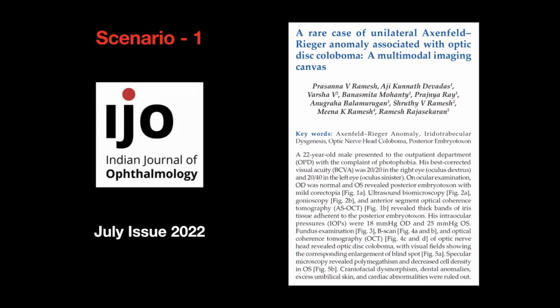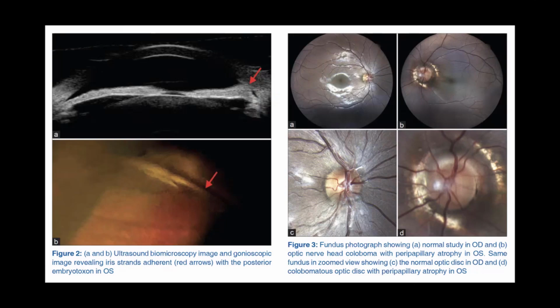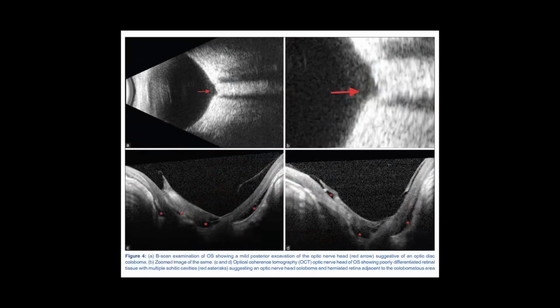And these are some of my PubMed indexed publications. Each image that I'm pitching, see how I am pitching it. See the corectopia, how you are pitching it. You have to give a prompt in such a way that the pupil should be seen being pulled towards the extreme, the nasal side. So when you're pitching it, see this, you're cutting it, the pupil has already gone to the other side, and you're showing the same syndrome matched with the ASOCT. So that gives you a story, a narrative, that when you pitch it like this, the concept is also understood. The readers understand it better, and you pitch your work in a better way.